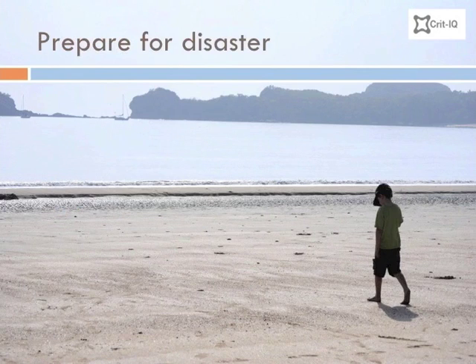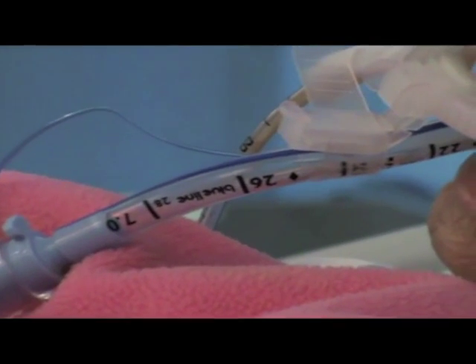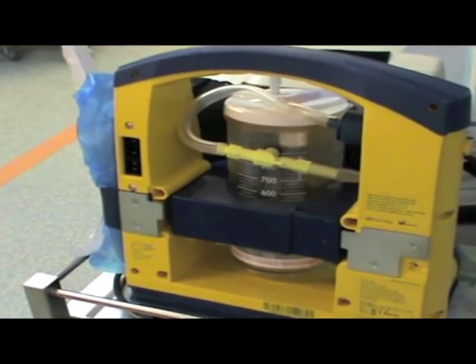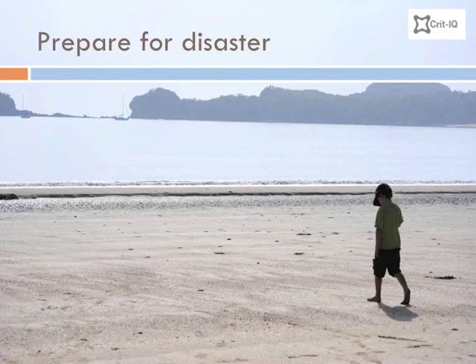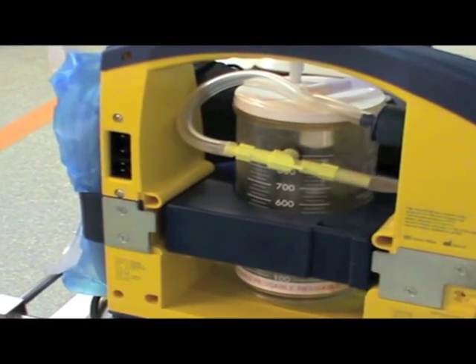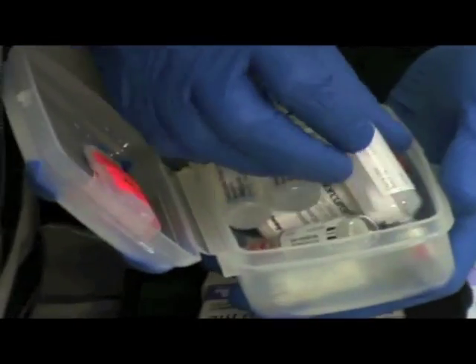Anticipation for all the events listed previously is essential. Have a strategy to deal with each one of these problems. Think through in your mind what you will do if any one of these events occurs at any time during the transfer. In particular, ensure that all IVs are thoroughly taped down, the endotracheal tube or tracheostomy tube is secure, and that you have all the equipment that you will need to deal with a disaster. You should have immediate access to a self-filling bag valve mask system and suction to be able to ventilate the patient, and enough oxygen and emergency drugs at hand to immediately deal with the crisis.